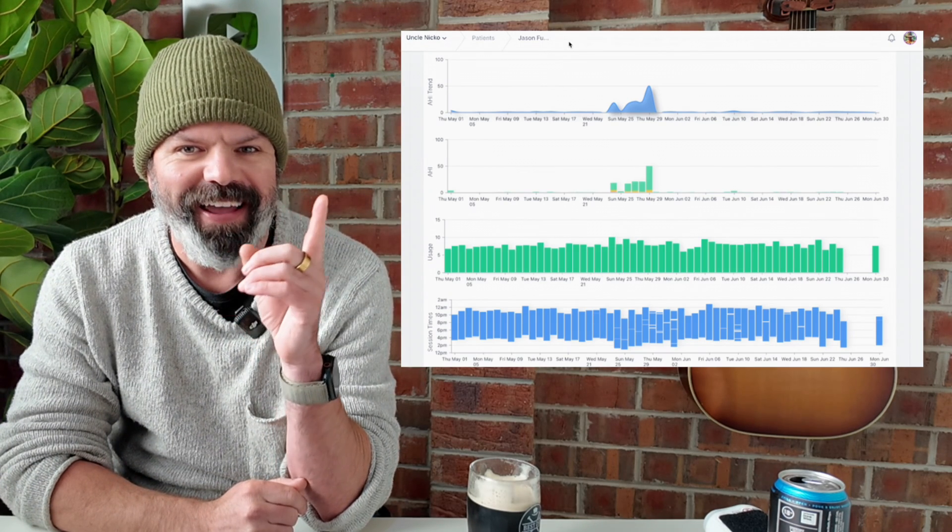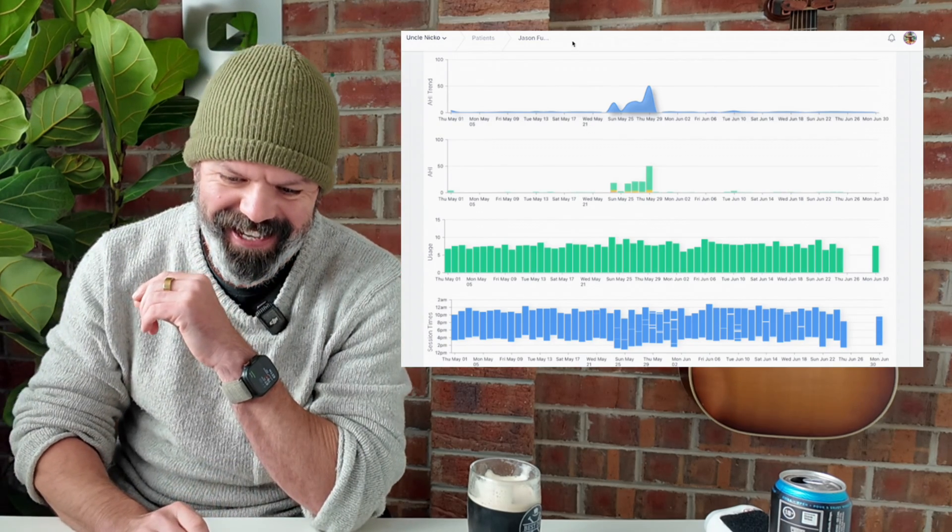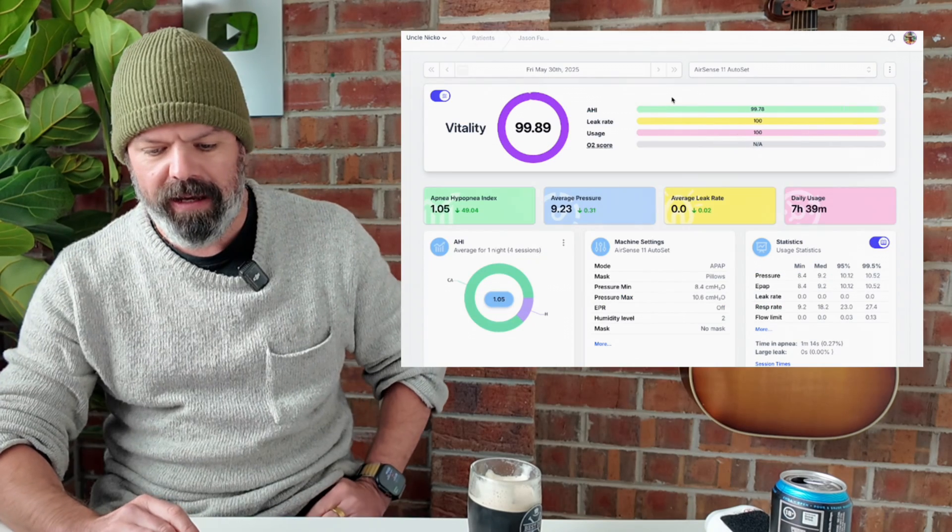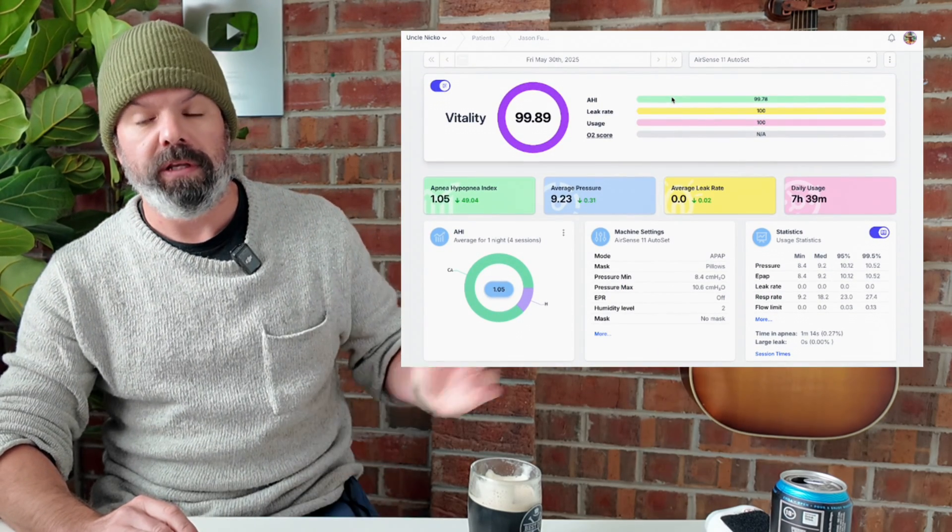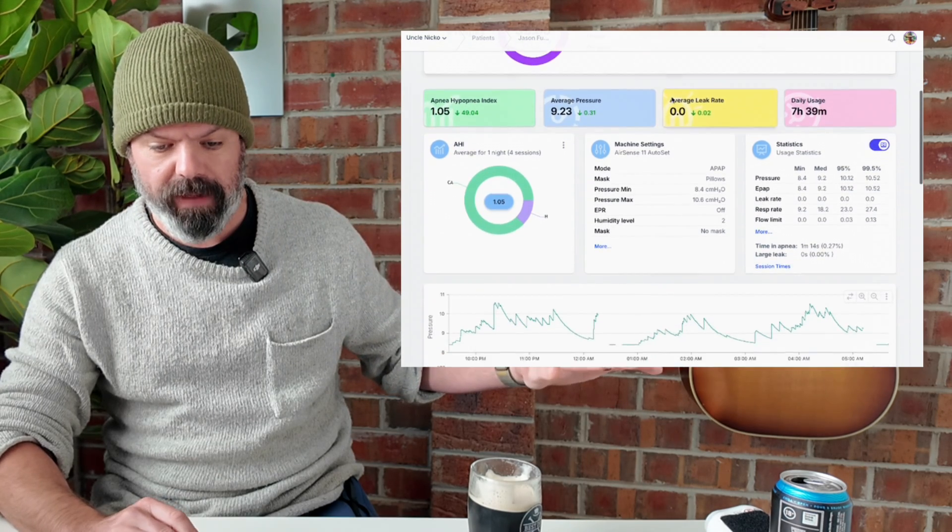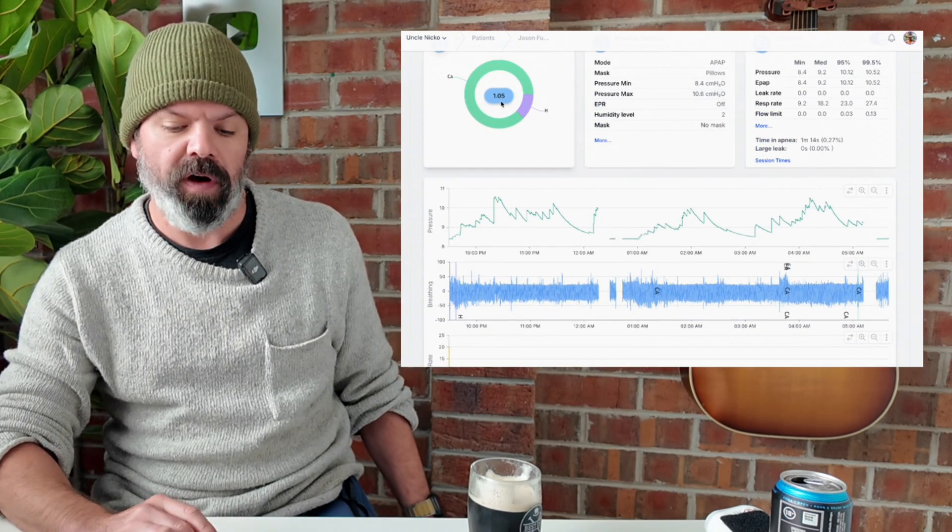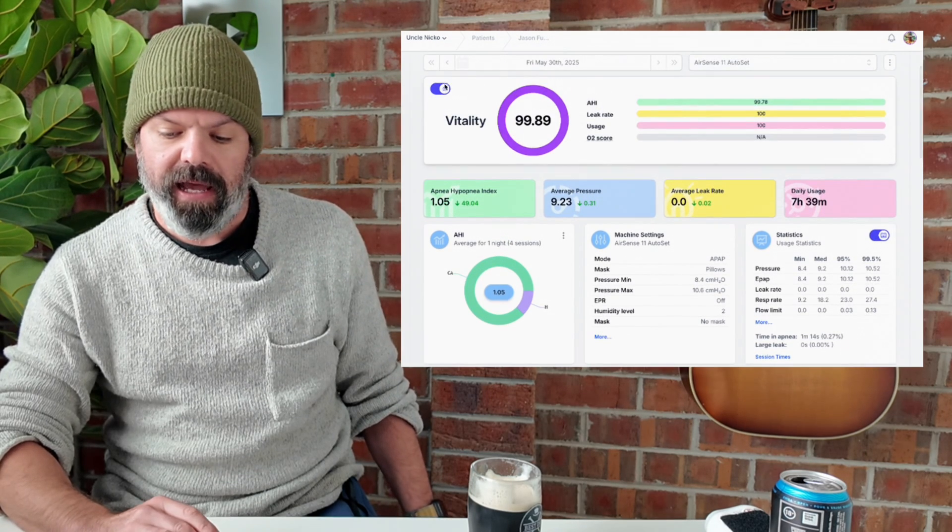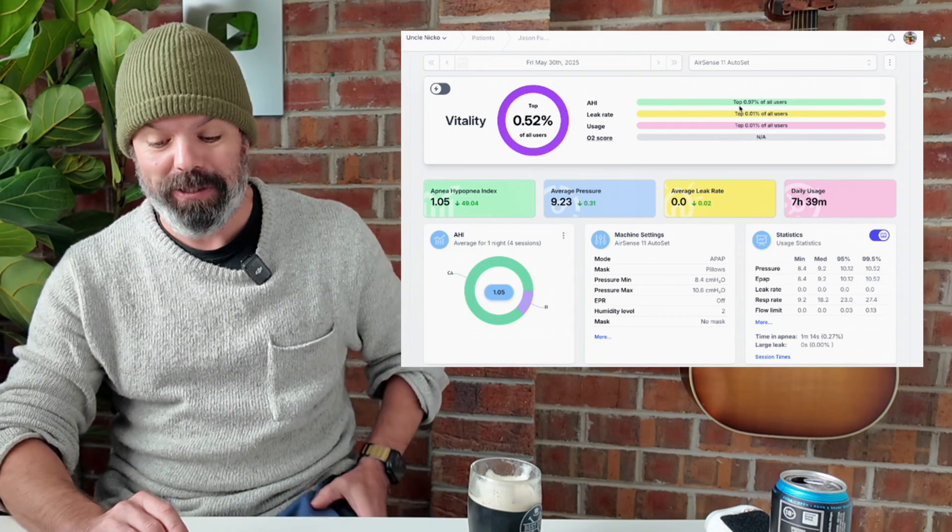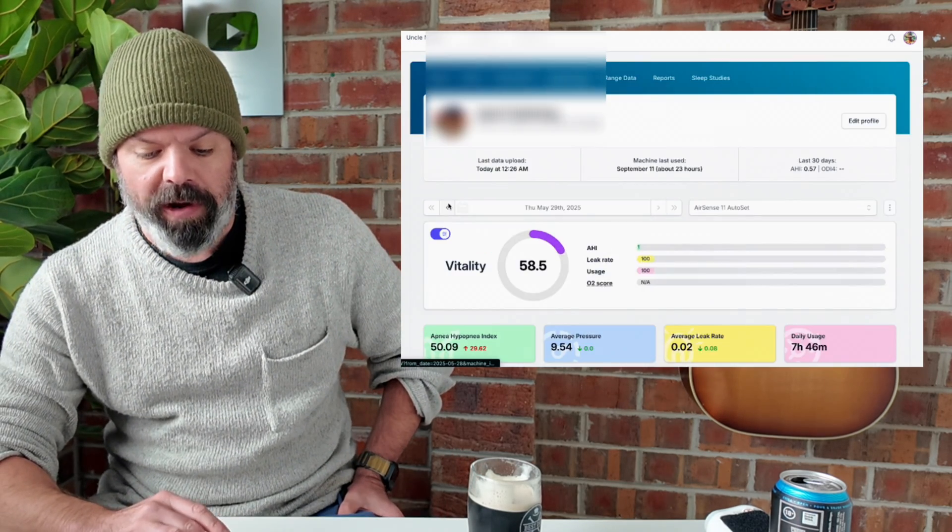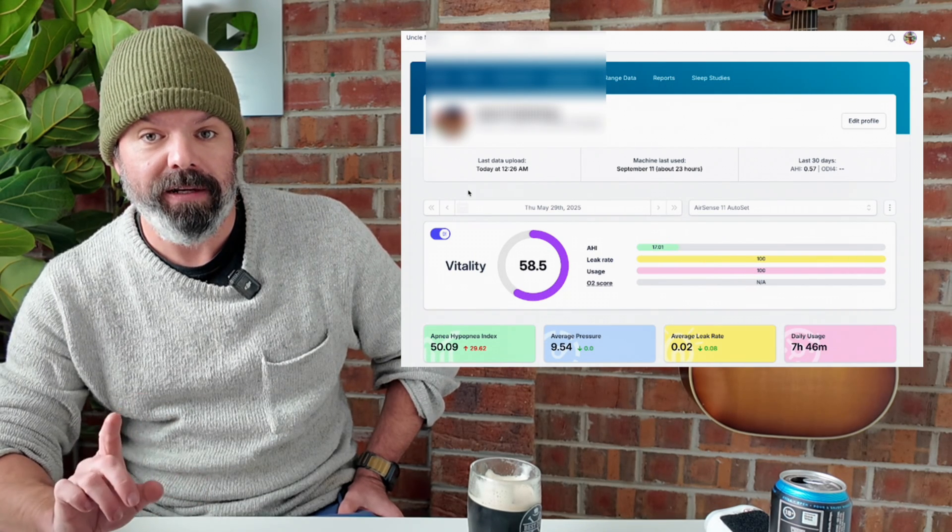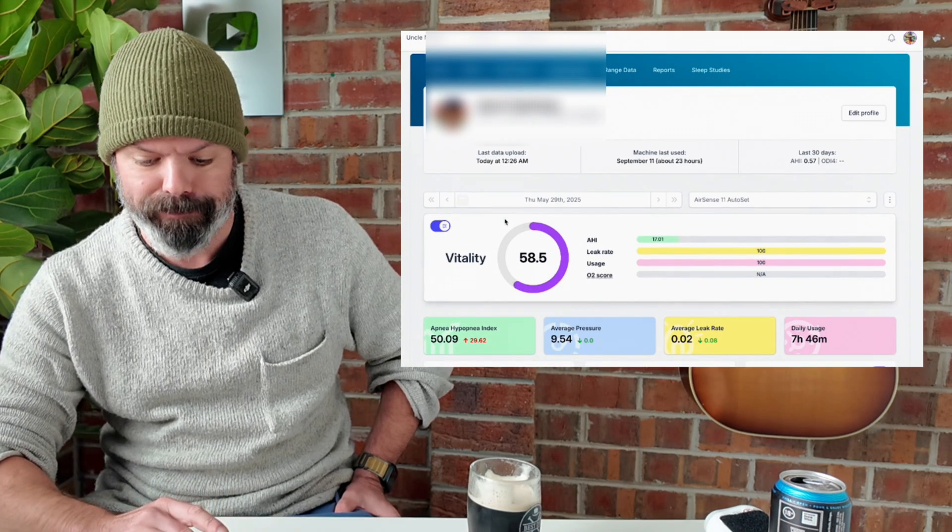High altitude. Let's check it out and then I'll explain what's going on here. Here are his results when he's at normal altitude and they're great. AHI 1.05, 99.89% vitality, and he's in the top 1% of all users on the SleepHQ database. So he's kicking goals. When he went on vacay, he went to New Mexico and I've seen a few people go to New Mexico now and have these results.